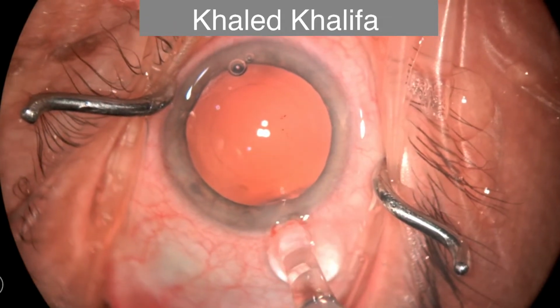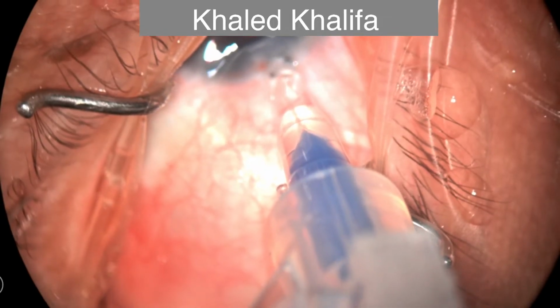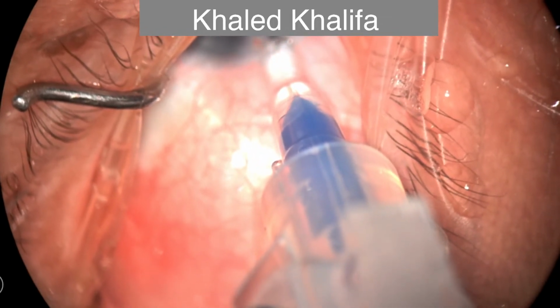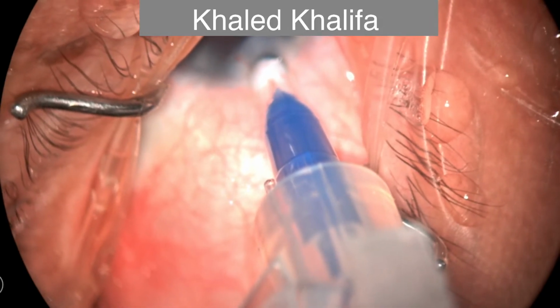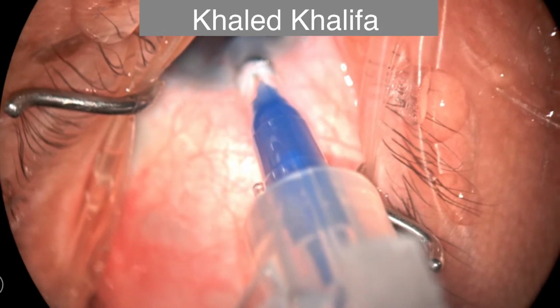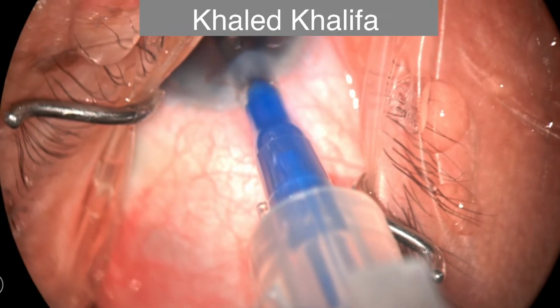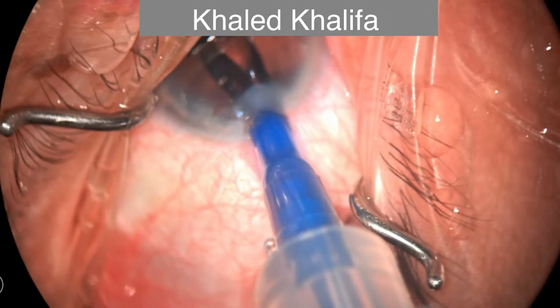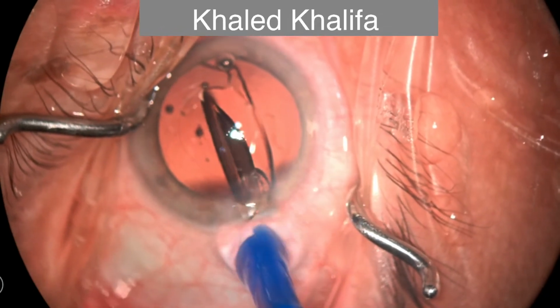Then proceeding with the IOL into the distal part of the cartridge to enter the eye, keeping pressure, keeping pressure, don't release, and you can release and repress. Yes, now the IOL is inside the eye.